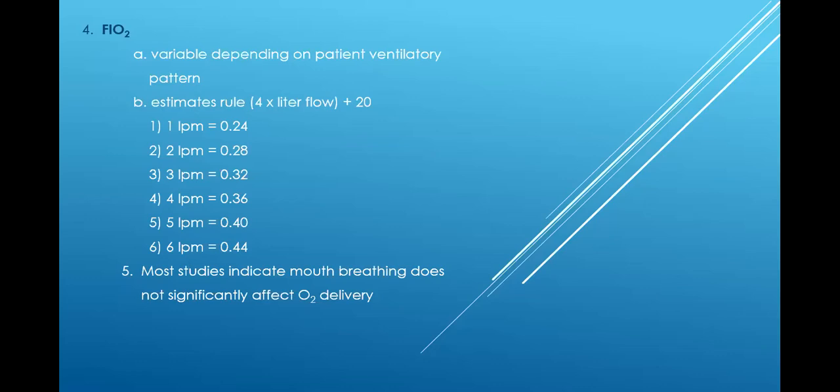It depends on what they need. You only give enough oxygen to stop hypoxemia. Now, if he's hypoxic, but he's breathing 1,000 times a minute, I can't start with a low flow device because he won't qualify. He has to have a high flow. And I can use a high flow at low FiO2s to beat the hypoxemia, right? But as far as which tool I use, it depends on how he's breathing, okay? You can be hypoxic breathing slow or hypoxic breathing fast. It just depends on the need of the patient, okay?